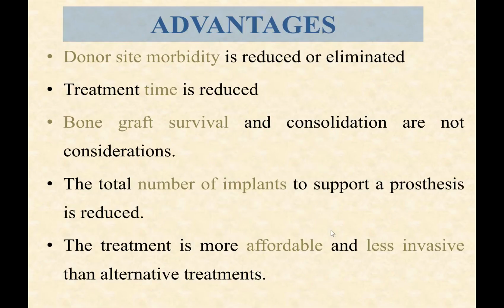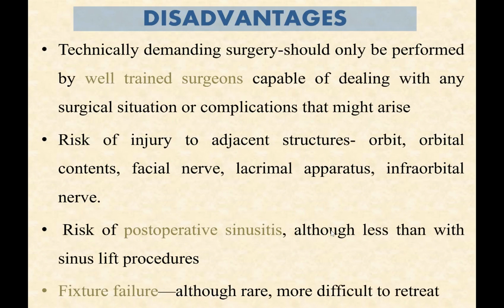The advantages of zygomatic implants are that donor site morbidity is reduced or eliminated, treatment time is reduced, and bone graft survival and consolidation are not considerations. The total number of implants to support was reduced. The treatment is more affordable and less invasive than other treatments.